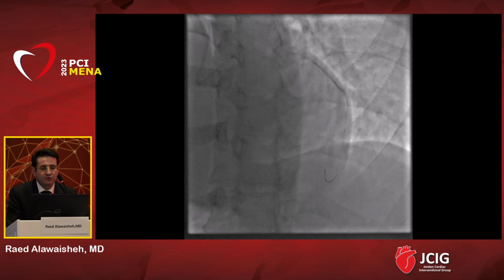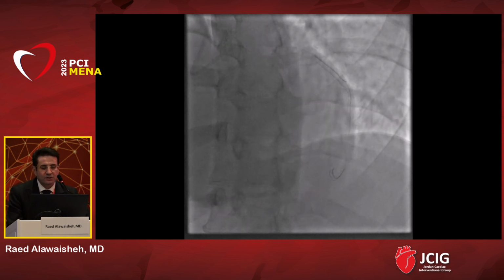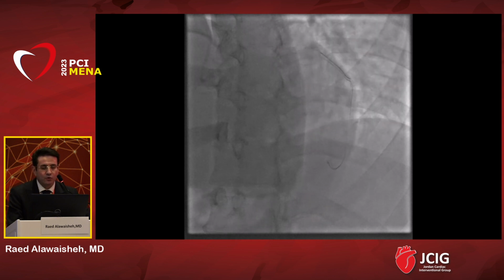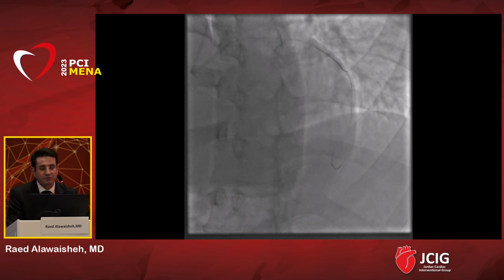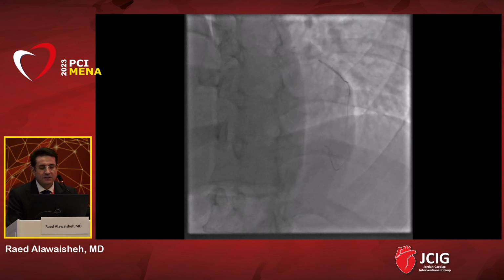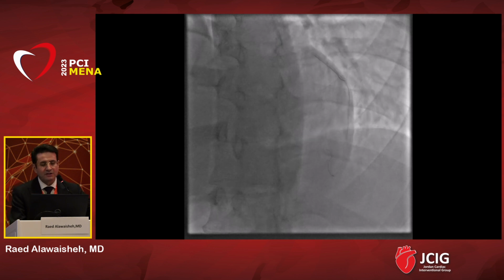Actually, we are pushing the microcatheter behind the SU03, because each wire, as a CTO operator, you need to know how it works. For example, for SU03, we don't push the wire as much as we let it go beat by beat and allow the microcatheter to support it. The opposite, for example, for the penetration wires like the Gaia wire, we have torque 1-to-1 and penetration.